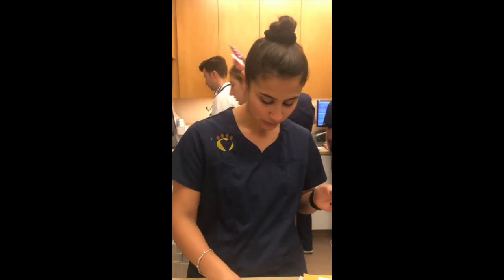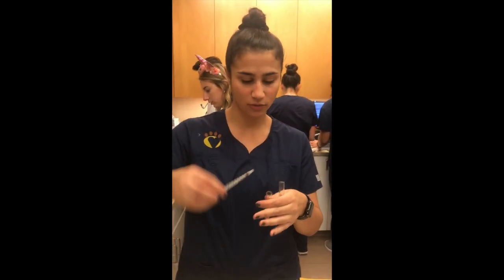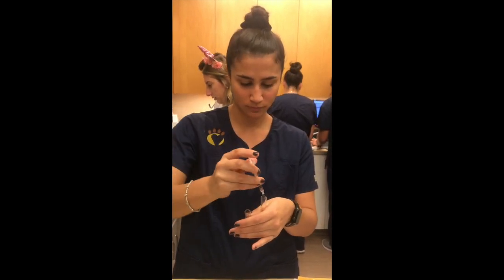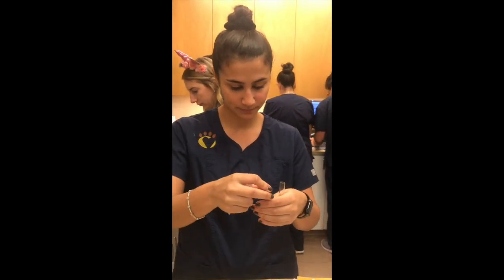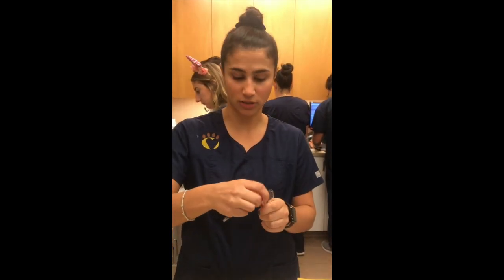Okay, so now we're going to do our control donor tube. So with that, I'm going to add 2 drops of our 2% erythrocyte suspension from our donor. Perfect. And now I'm going to add 2 drops of our donor serum.